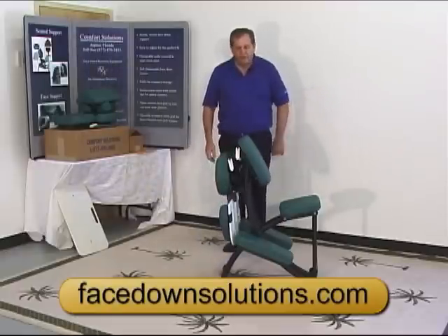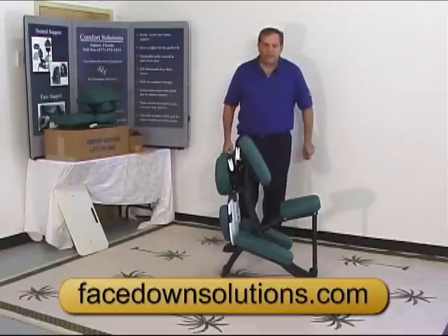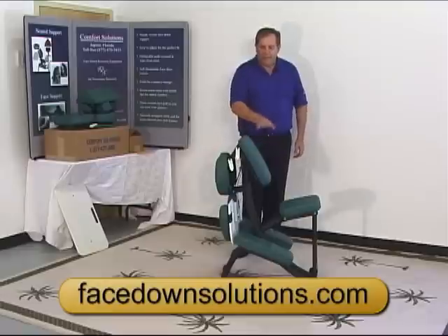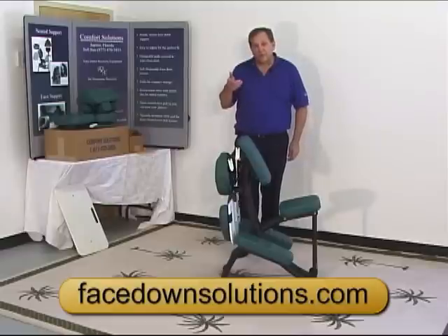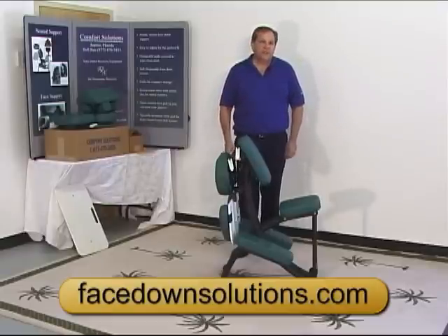Now what I'm going to do is walk into the chair from behind — I don't want you getting on it like you're getting on a horse. I'm going to lean against the chest cushion. With one hand I'm going to bring the crescent cushion up to my face, and with the other hand I'm going to lock the levers in place.